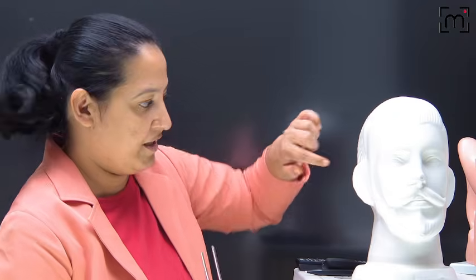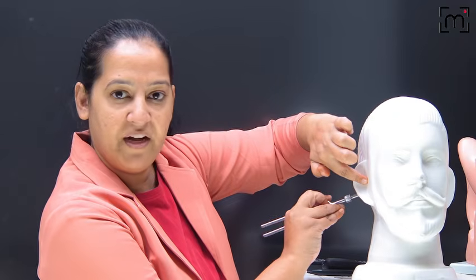If I am activating it, blocking the tragus and keeping it here, the patient hears for 5 seconds. If I am activating it, blocking my own tragus and keeping it here, I can hear for 10 seconds. So the patient hears for a shorter duration, and I hear for a longer duration. The examiner hears for a longer duration. So the patient has some defect in the cochlea. The patient's cochlea is only 50% or less activated. That's why they hear for a shorter duration. So the patient has sensorineural deafness.